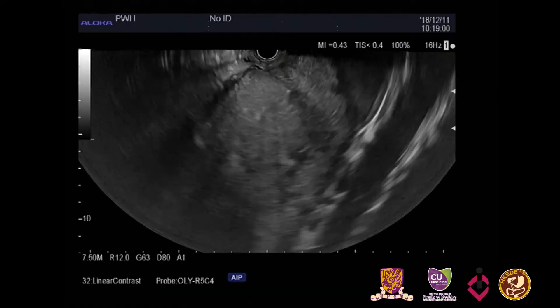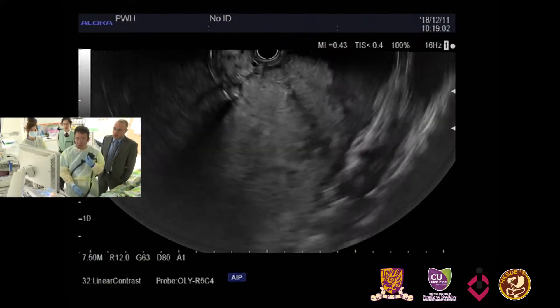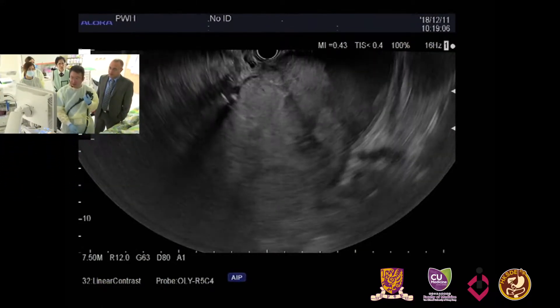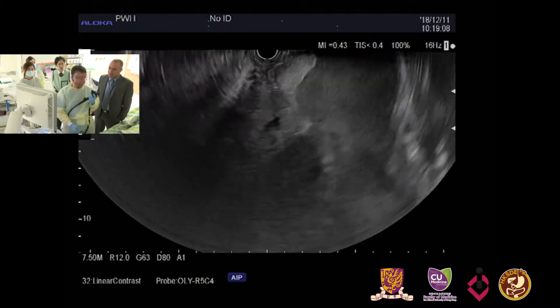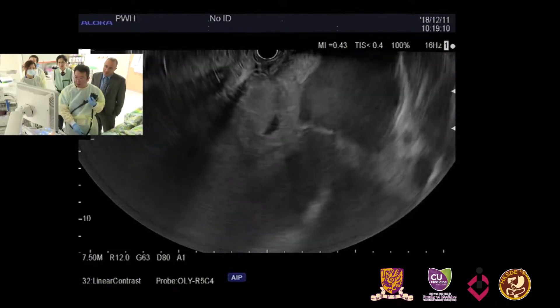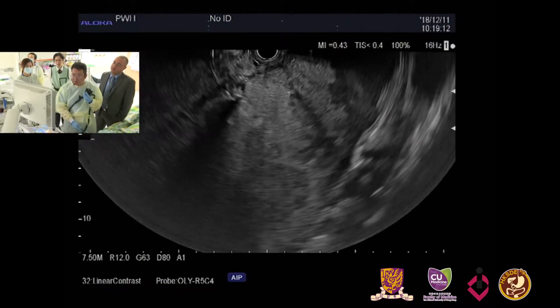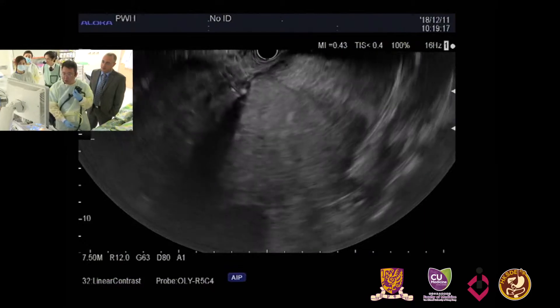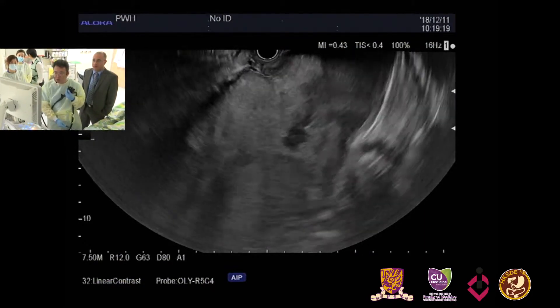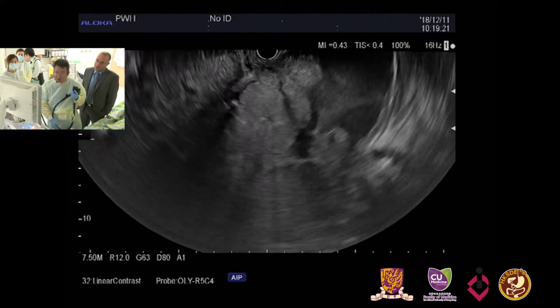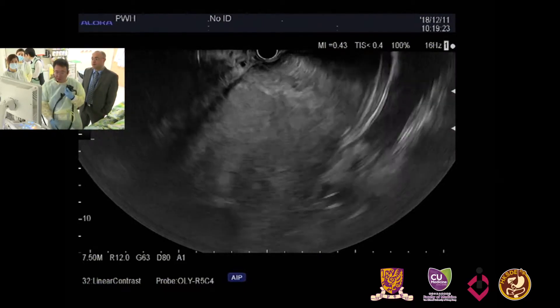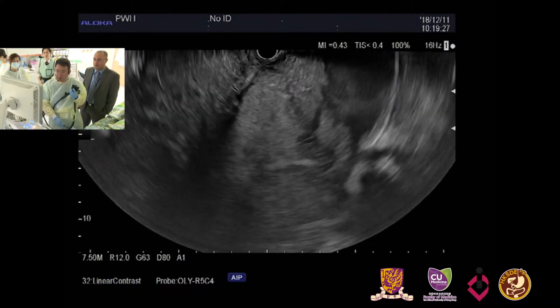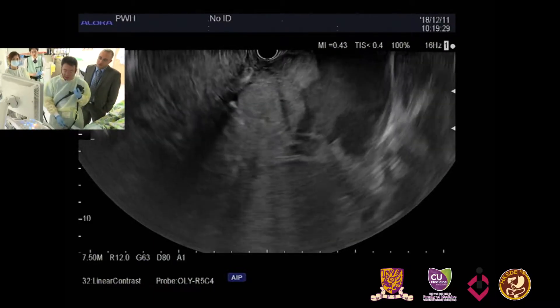I'm Shopo Wang from Taiwan. My partner is Professor Kapshap from the USA. The case: you have heard of a 60-year-old male suffering from abdominal pain, and a huge abdominal mass was noted on CT scan. Looking at the CT scan, I think there is also a possibility of pancreatic origin because the spleen and pancreas were compressed severely.